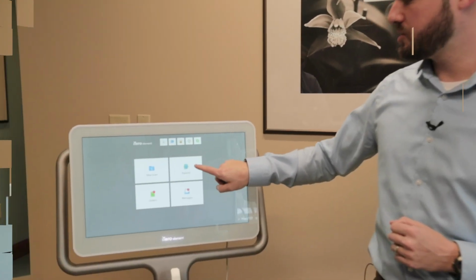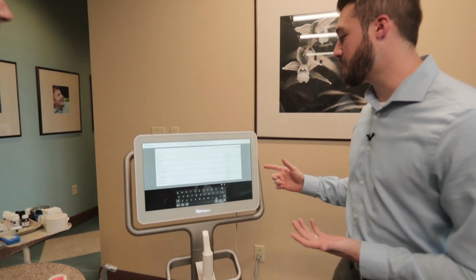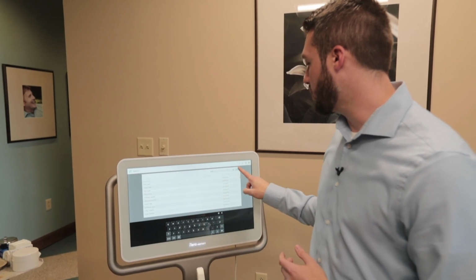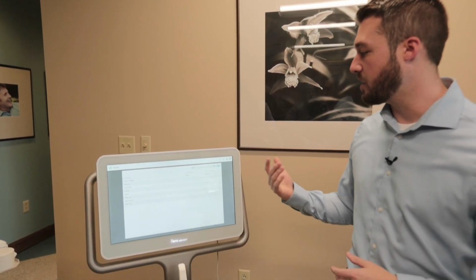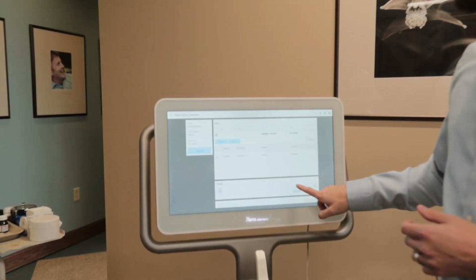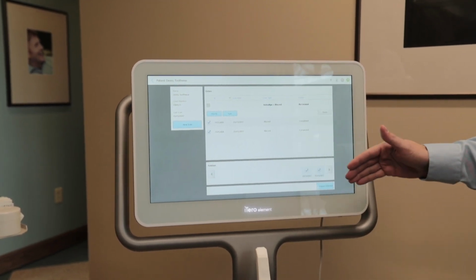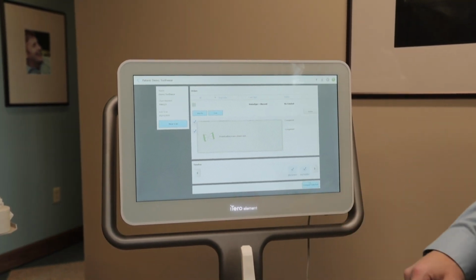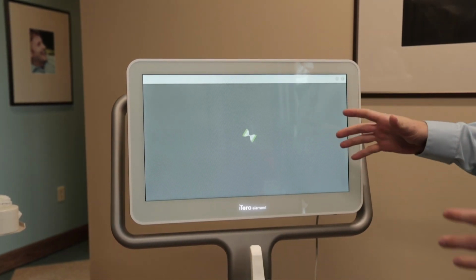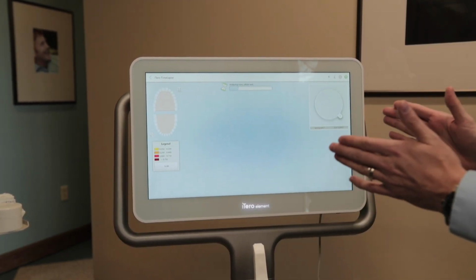Perfect. All right. So just to get started, we're going to talk about pre-case acceptance. Dr. Rice did a great job explaining that earlier. I just wanted to show a few quick demos here. We're going to look at both soft and hard tissue in the mouth and compare that over time. So I'm going to use what's called time-lapse technology. We're taking 2 scans for this patient and comparing them over time. For demo purposes, they're on the same day, but I want to build that conception of what's happening and what we can take that patient through.